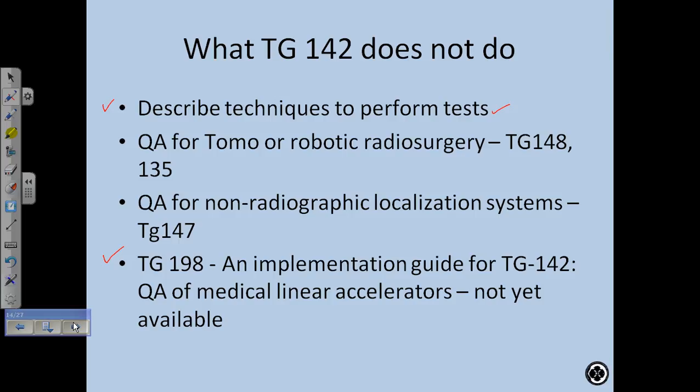So what else does TG142 not do? There's no QA for tomotherapy or robotic radiosurgery. I think these two TGs do address QA of tomo and robotic, so they're separate TGs.